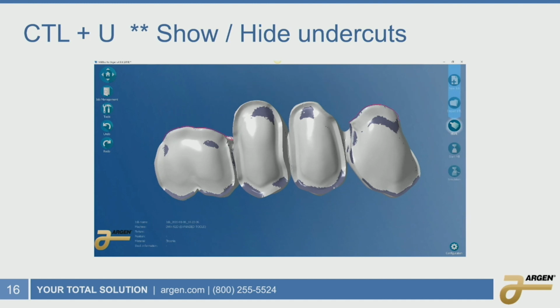Some users like to see these undercuts because it helps them place the sprues in a proper position, and some users don't like to see these undercuts at all. So it just allows the end user to pick and choose what they're looking for.